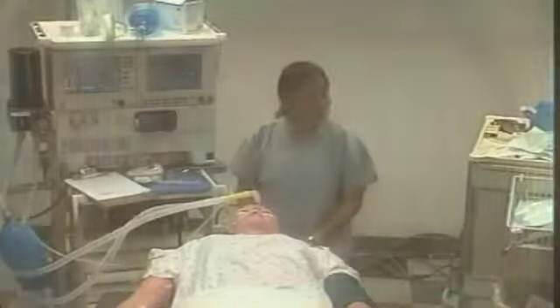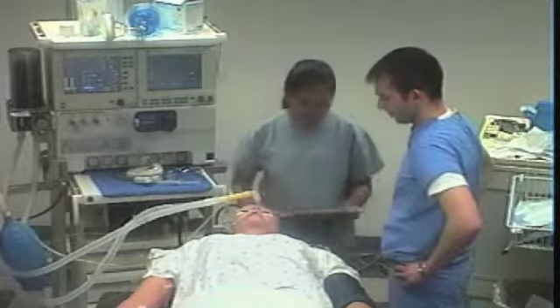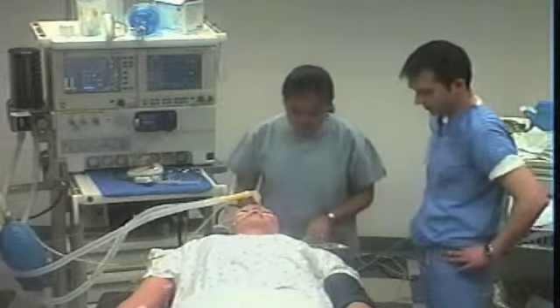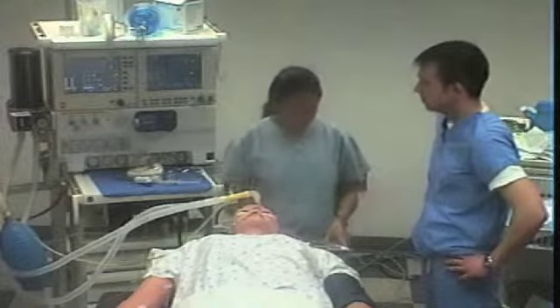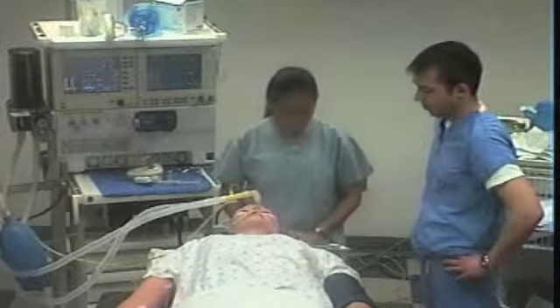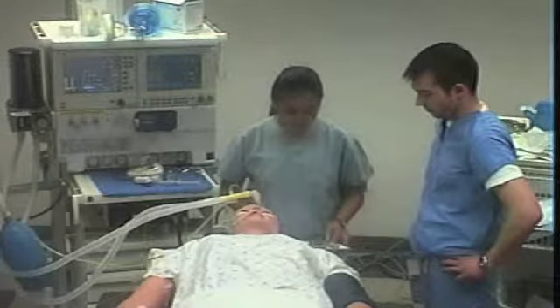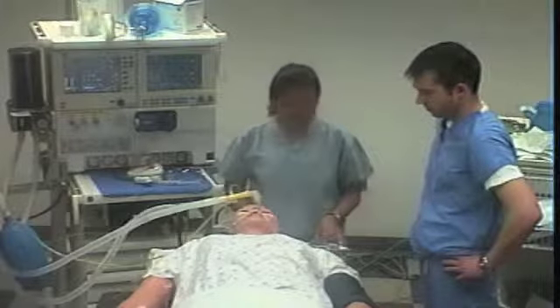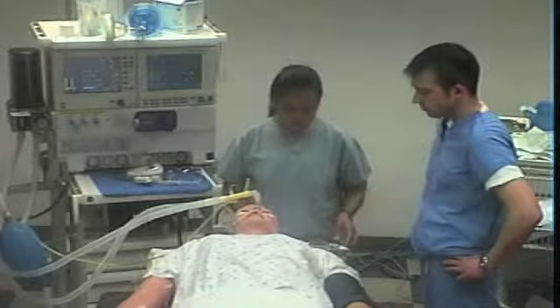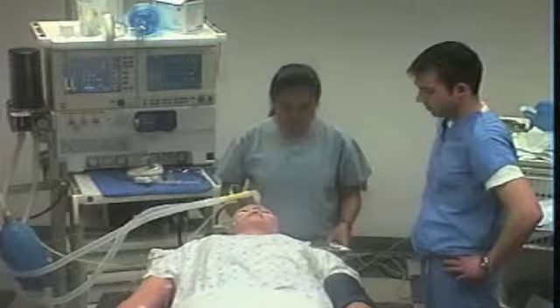Hey Finkel, I'm here to relieve you for lunch. Hi, thank you. Let me give you a report on him. This is Mr. Gus. He's a 46-year-old male under general anesthesia for inguinal hernia repair. He weighs 70 kilograms and he's 6 feet tall, and has a history of cigarette smoking. He smokes 1 pack of cigarettes a day, and no other medical history. He got intubated uneventfully 20 minutes ago, and he's tolerating his anesthesia well.